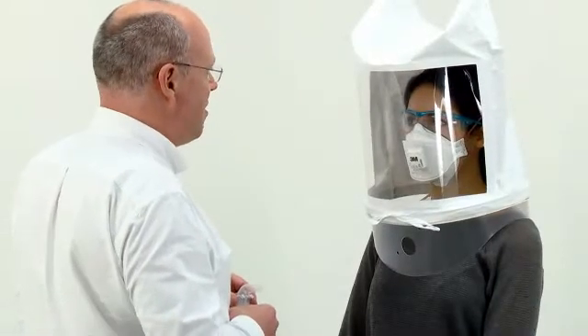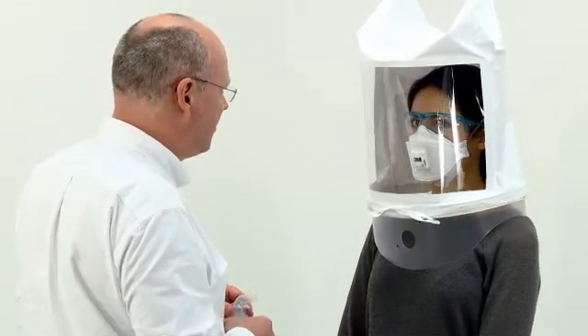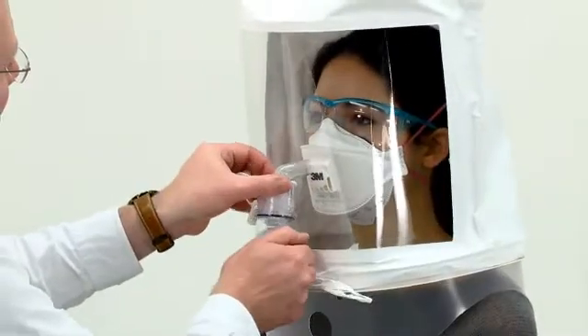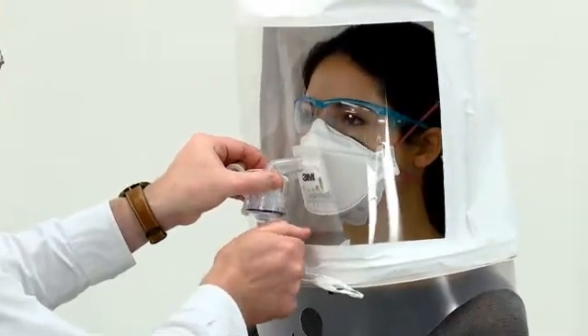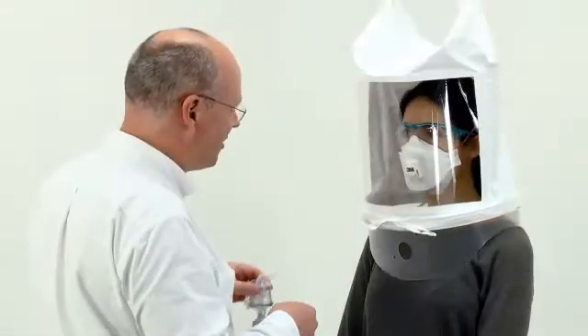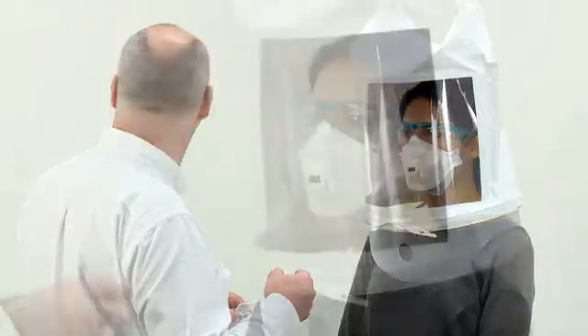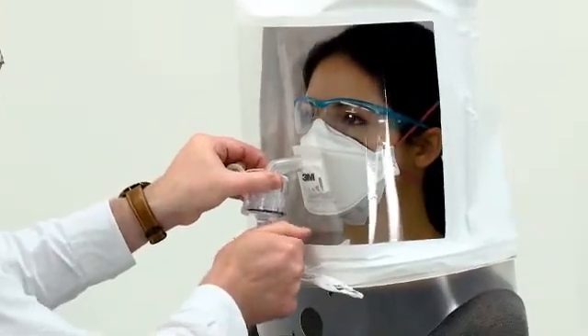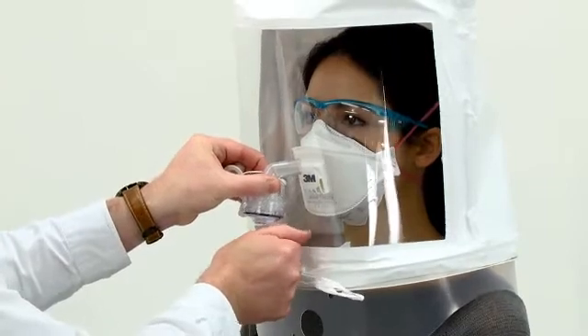For the first of the 7 exercises, ask the subject to breathe normally and start a stopwatch or note the time on the second hand of your watch. After one minute of normal breathing, ask the subject to start deep breathing, taking care not to hyperventilate, and remember to top up the concentration every 30 seconds. After one minute of deep breathing, ask the subject to start moving their head from side to side in slow, deliberate movements, pausing slightly to inhale at each extreme.